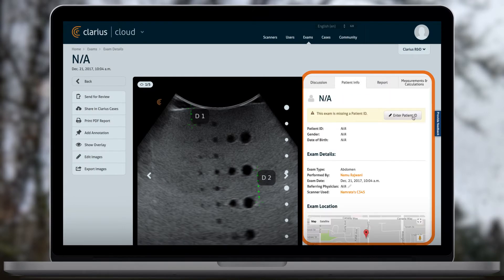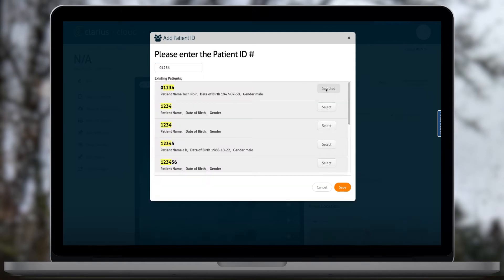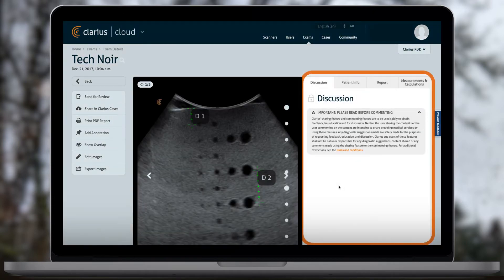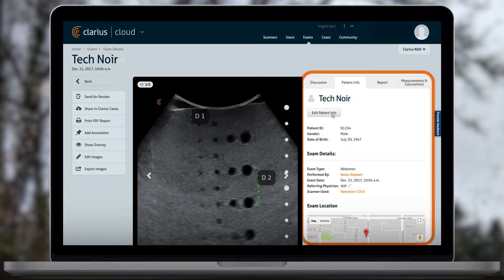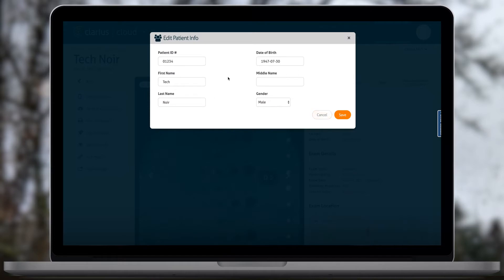If you don't fill in the patient details while using the app, you can do that now. Click on Enter Patient ID to attach a patient to this exam. Once the exam is associated with a patient, you can edit the patient information by clicking Edit Patient Info. Keep in mind that this will save the patient record across all exams that reference this patient.